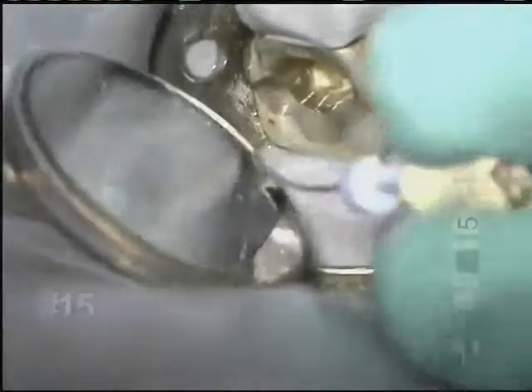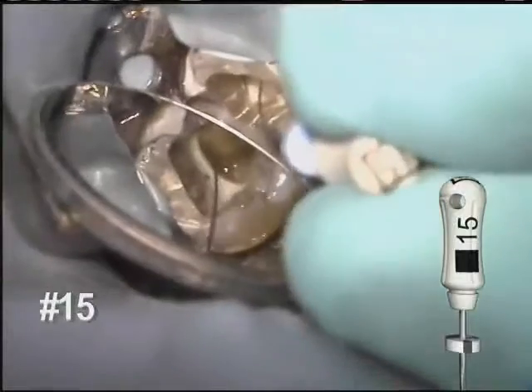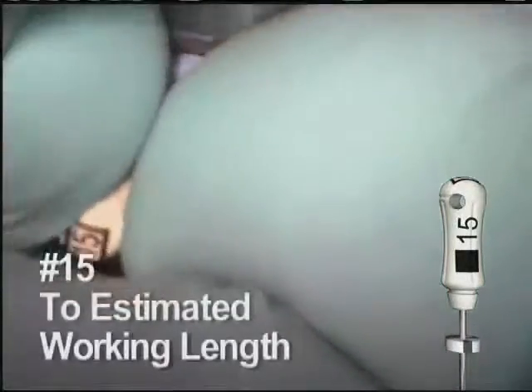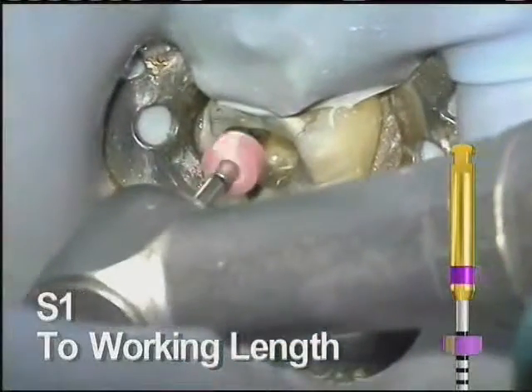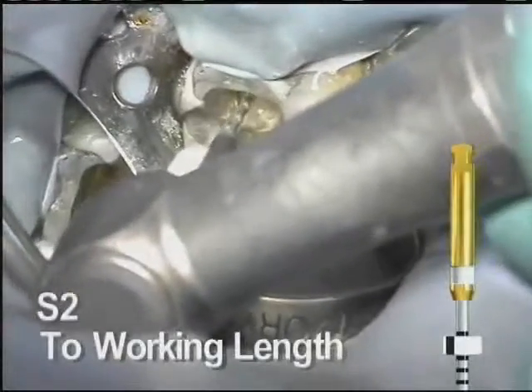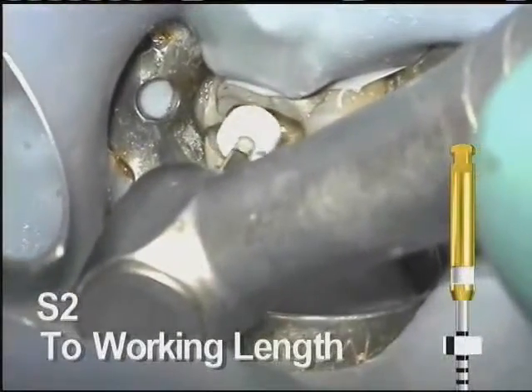The number 15 hand file is then allowed to follow. These instruments create enough of a glide path to allow the ProTaper Universal instruments to comfortably shape the apical portion of the canal. S1 is reintroduced and is easily taken to length. Once it reaches working length, remove it. The S2 easily follows to length and the canal has a nice tapered shape throughout.